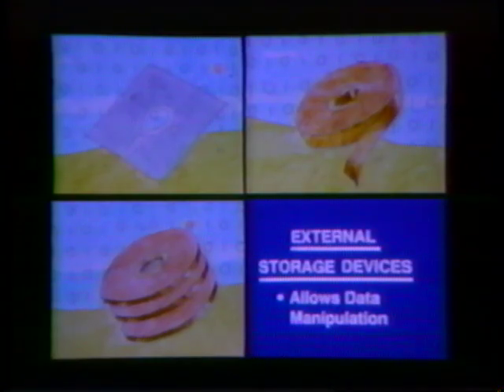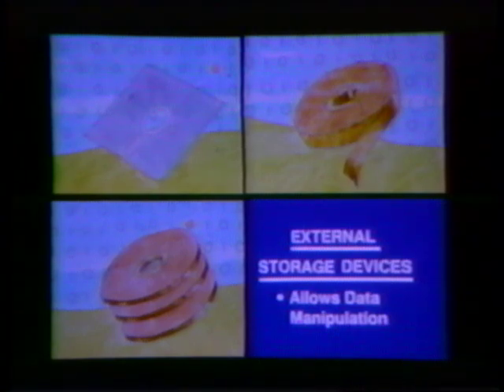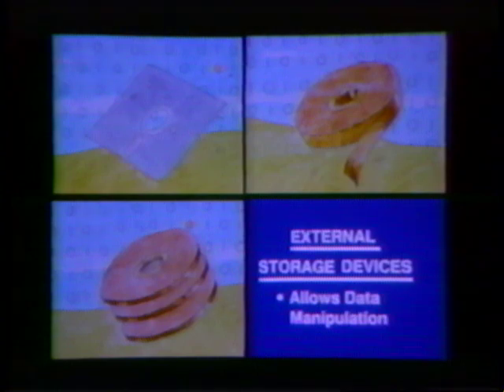For this reason, computers usually have external storage devices associated with them that allow storage of the data in a form that permits it to be loaded back into the computer memory, as if it had just been acquired from the camera. Data stored in this manner can be recalled at a later time and further manipulated if necessary. In the following paragraphs, we'll discuss the various storage devices available for nuclear medicine computers.